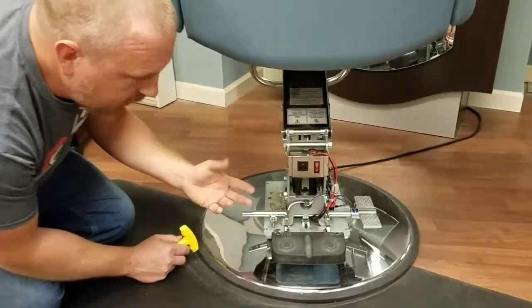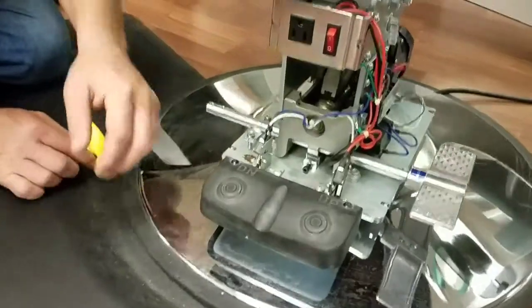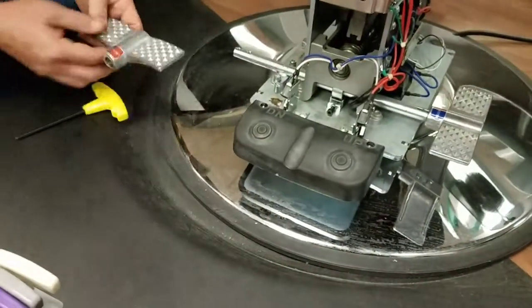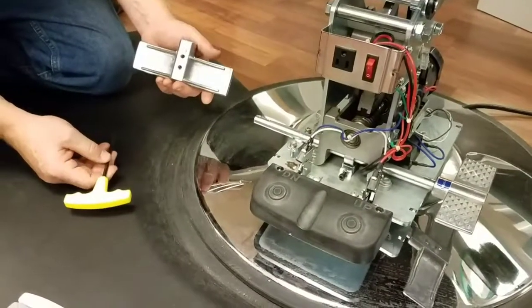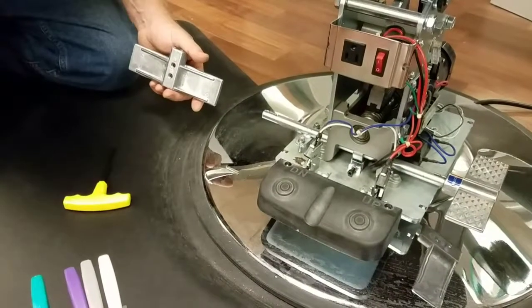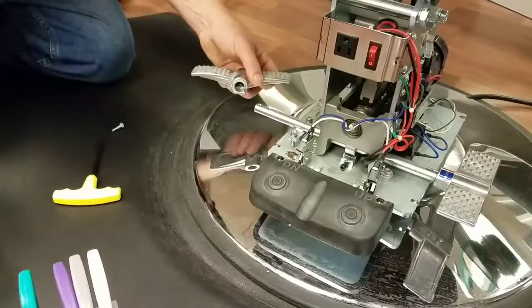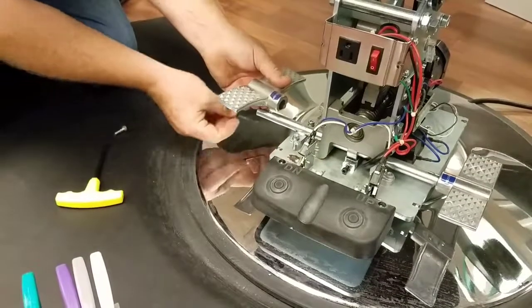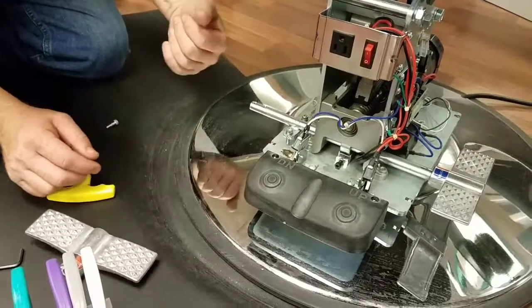We've already taken off the plastic shroud, and in order to do that, you have to take off these pedals. To do that, you use a four and a half or five millimeter Allen wrench. You do have to have one that's a right angle in order to reach under there and get it off. So we've got that off and we've got all the plastic shroud off.